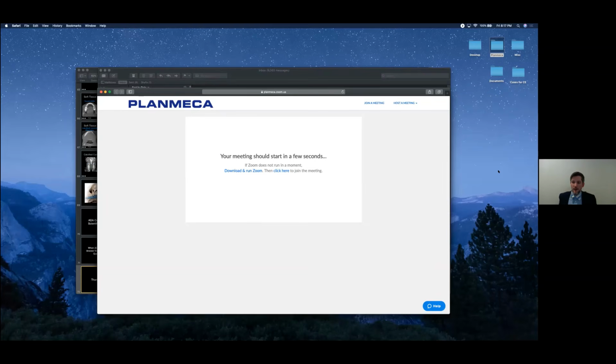It just depends on the company, number one, and the settings that you use. So with Planmeca's low dose option, you can take a scan of a quadrant, a small field of view scan, for like the dose of a PA. So it's pretty powerful technology.